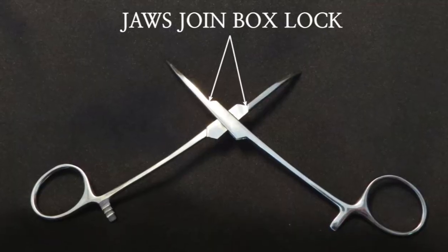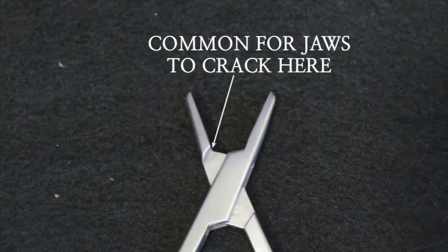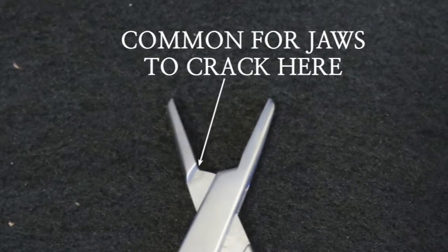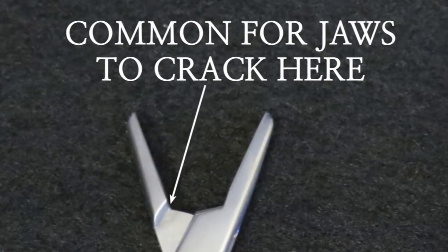Cracks will also be found where the jaws join the box lock and where the box lock joins the shank. Pay close attention to the jaws on needle holders, as the jaws are known to crack where they join the box lock.